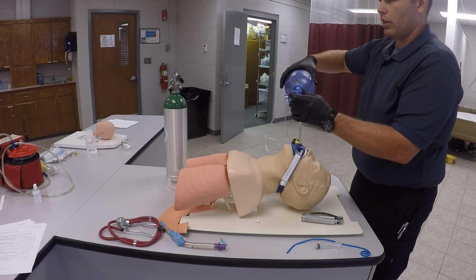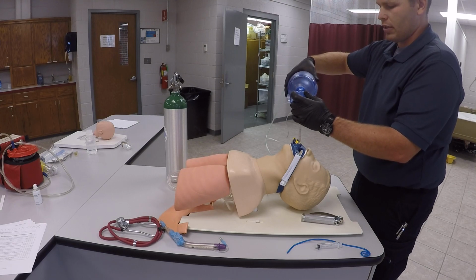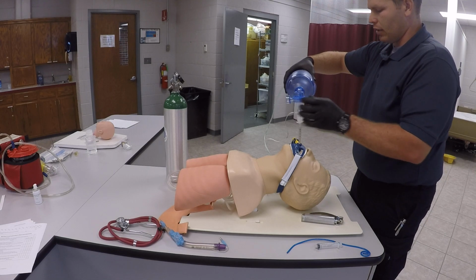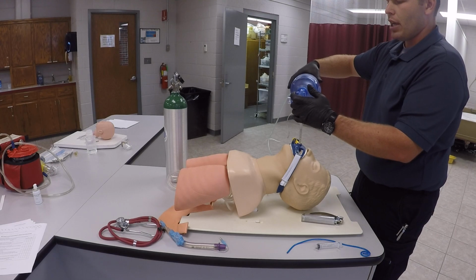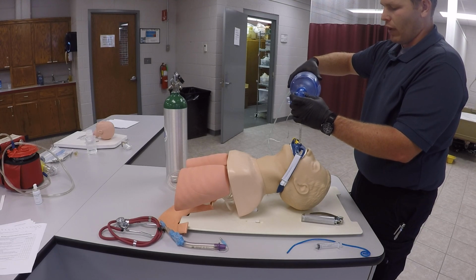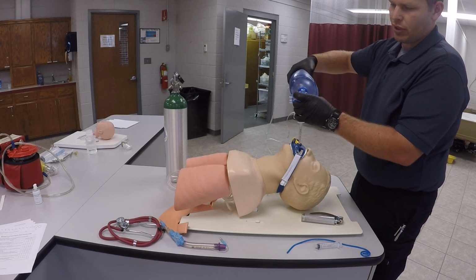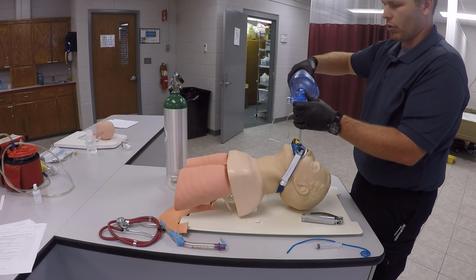Alright, then we'll consider the need for a cervical collar, just kind of help keep everything in place. Since the patient is paralyzed, they won't be able to hold their neck very well. So we'll consider the need for that. And then we'll continue to monitor our CO2, SpO2, ECG readings, and assess the patient's vitals every 5 minutes. If we need to give additional sedative doses, we can consider that per your local protocol.